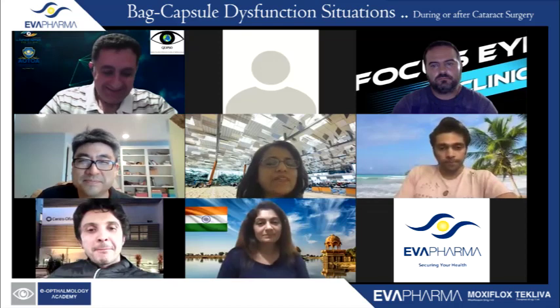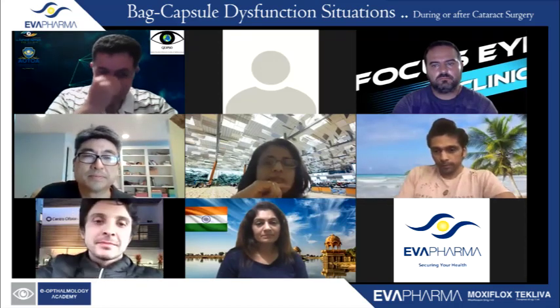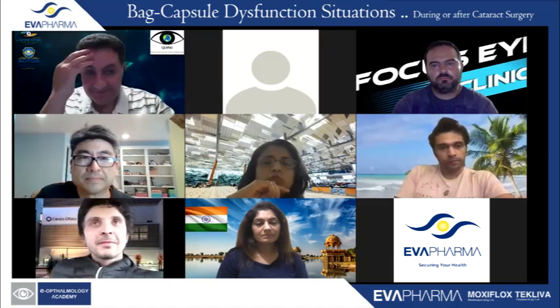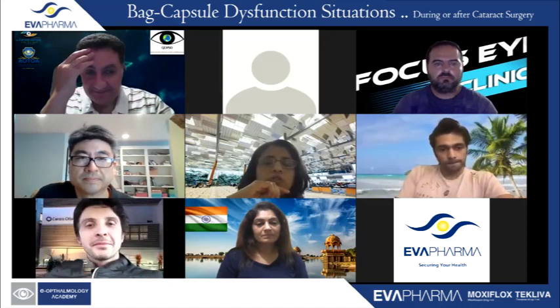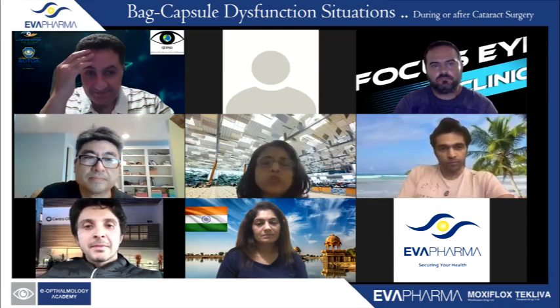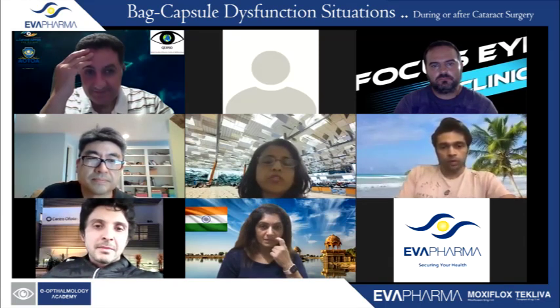Sure. I think one thing I'll just say here is what Brian said is absolutely right. If you're doing this, there's no downside to it. So even if you're stuck and you lose the capsule or whatever, you already have the glued IOL flaps in place. You have the IOL which you planned for this. Everything remains the same, you just go ahead and do a glued IOL. So the downside to it is really low.